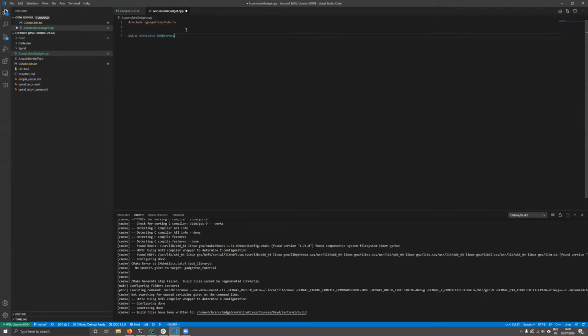So first, we're going to go using namespace Gadgetron because otherwise we get to write Gadgetron a lot. And it is a nice name, but let's not spend the entire day doing that. Then we create the accumulate gadget, and we want it to inherit from another gadget, a core channel gadget. So the channel gadget, well, I'll show you what it does, but it needs a type. It needs to know what type of data you want to be receiving, essentially. And for this gadget, we want to be receiving acquisitions.